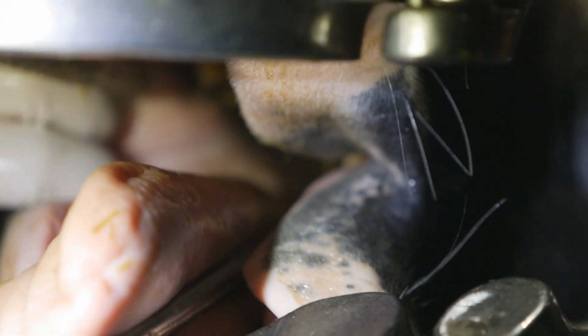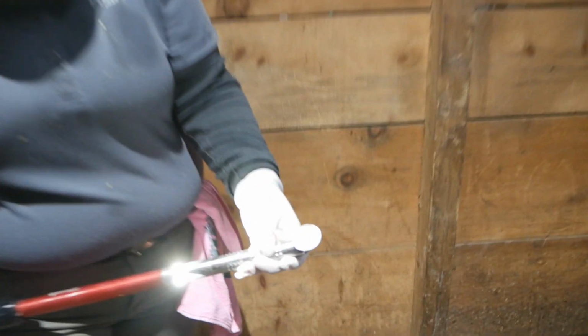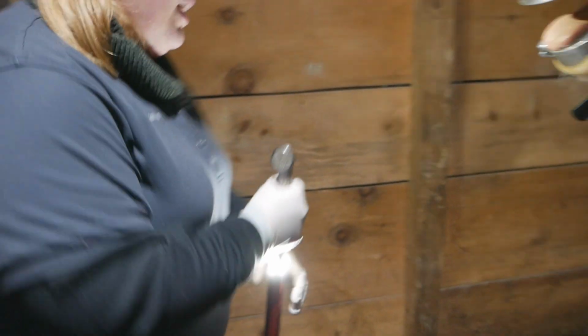Awesome. He doesn't have any problems like shaking his head? He was flipping his head a little bit this summer, so. Well, this might help a little bit with that. Sometimes it's fixed, sometimes it doesn't absolutely fix our problem. I use a power tool. It has a diamond grinding head, and it spins and grinds down the teeth with a fun power tool. And we can move the head if we need to bend it.